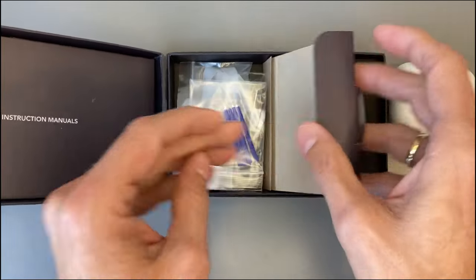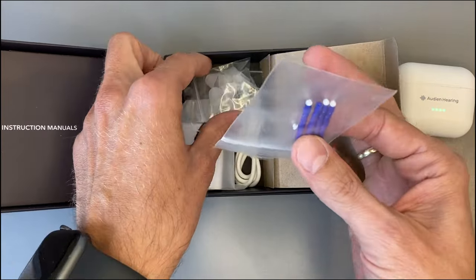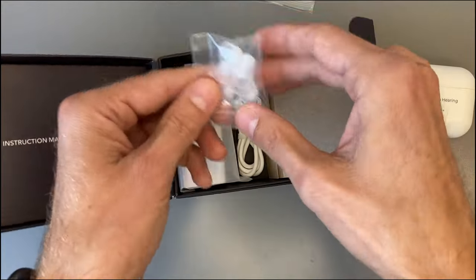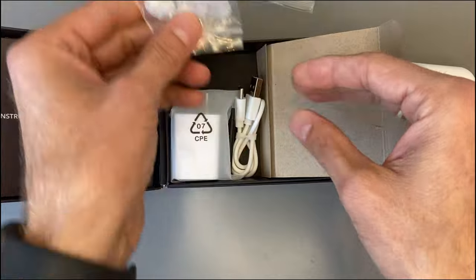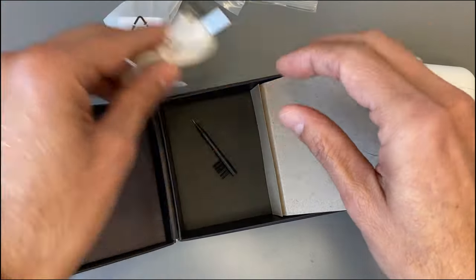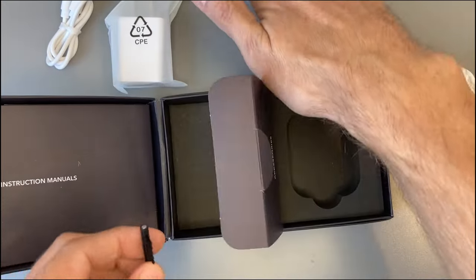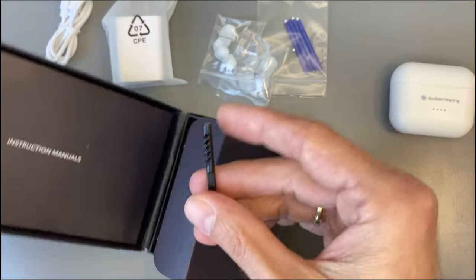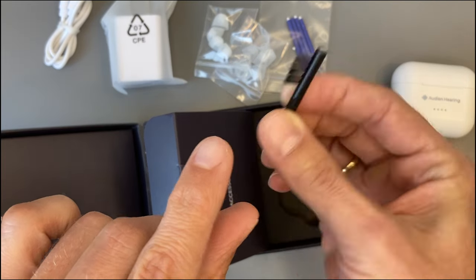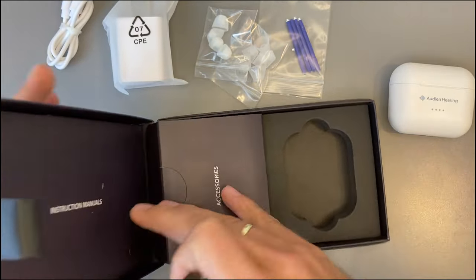For accessories, we have earwax filters — always good to have these — extra eardoms, a wall plug, a charging cable, and a multi-tool with a small brush, a magnet, and a small metal loop.